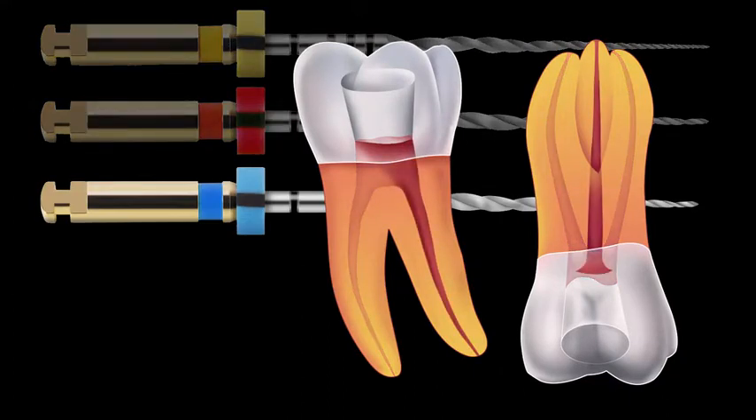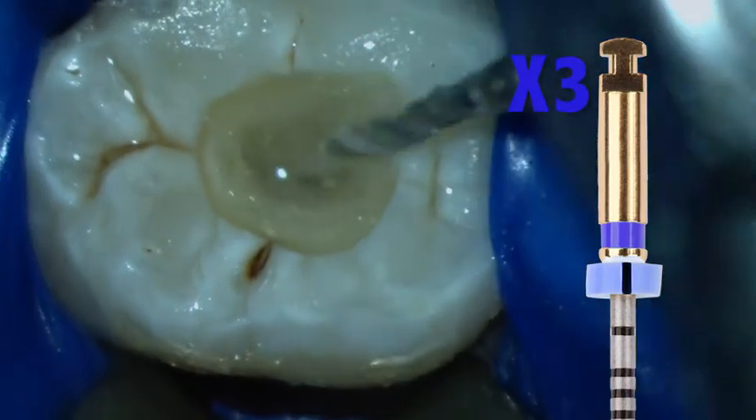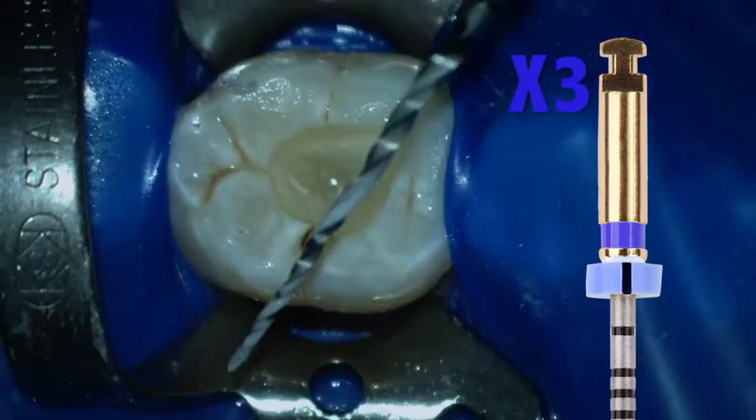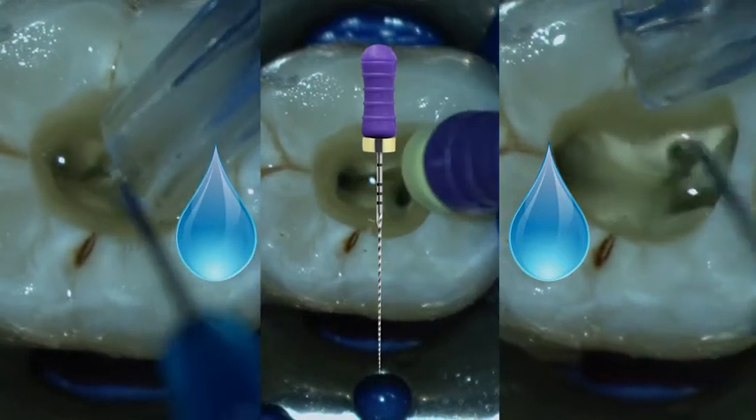Larger canals, including the distal canal of this tooth, may also require the use of a third instrument. Here we introduce the X3. This is again followed by recapitulation with a 10K file and irrigation with sodium hypochlorite.